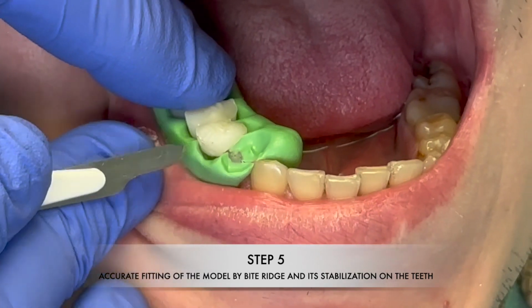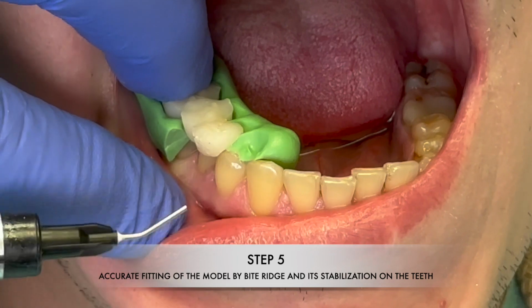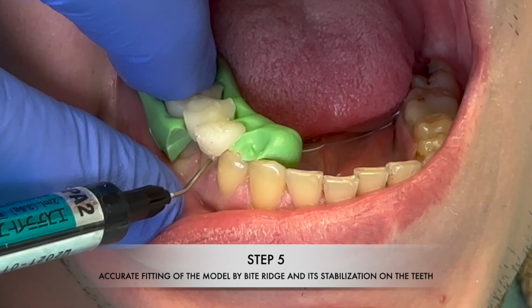To do this, we use a fluid composite to create an accurate fixation of the adjacent teeth from the restored one with the teeth of the plastic model.